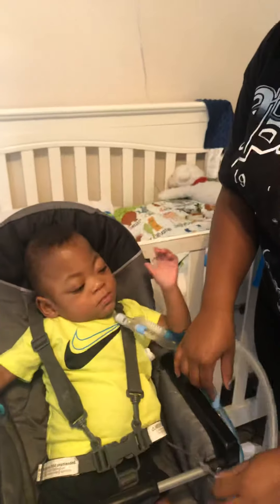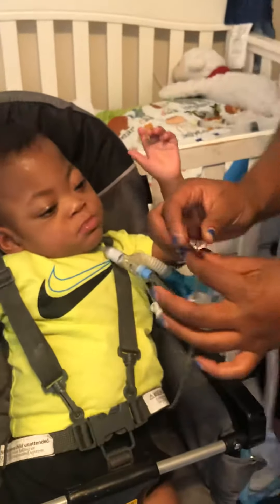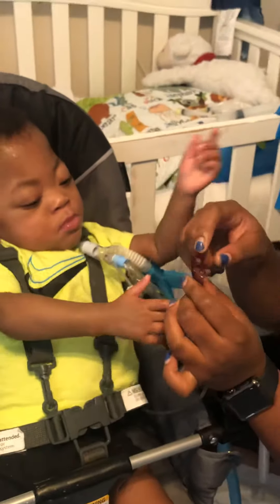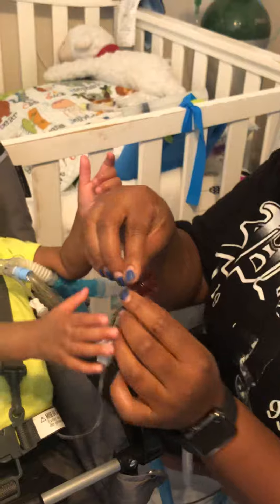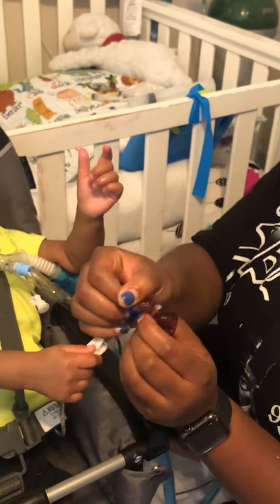You're going to get the G-tube. This is his G-tube, and it has two ports. This port is for his meds, and the smaller port is the one you're going to open.